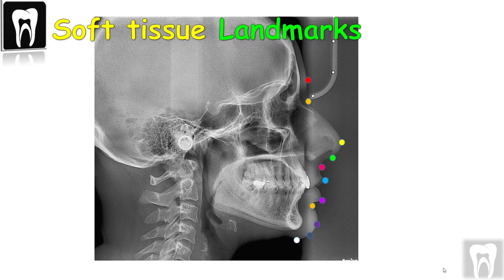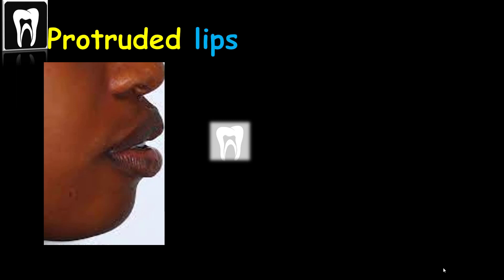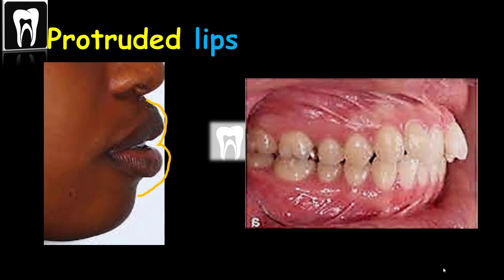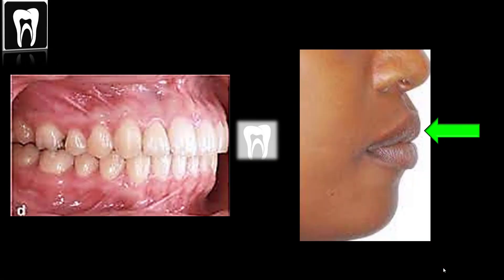We have some soft tissue landmarks. Why do soft tissue landmarks matter? The orthodontic treatment of the jaws and teeth can depend on the soft tissue. For example, if the lips are too protrusive, we can retract the misaligned teeth. Or, on the other hand, if the lips and soft tissue are retracted, we can protrude the crowded teeth. So let's see the important soft tissue landmarks on the lateral cephalometric radiograph.